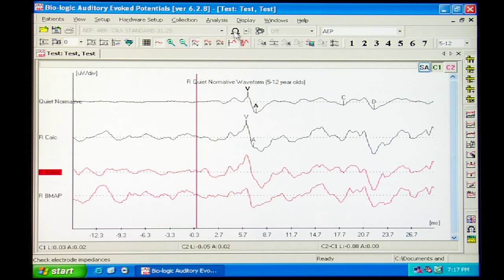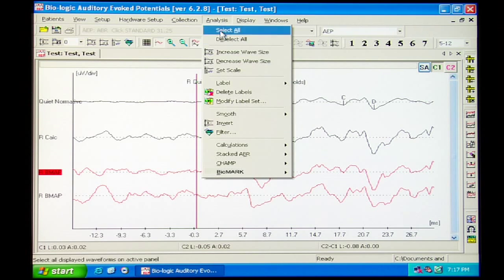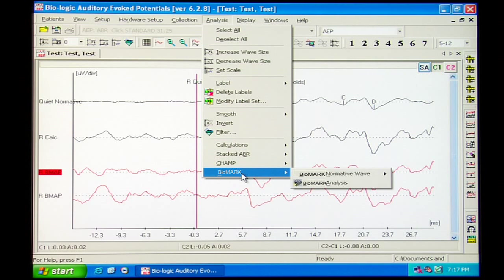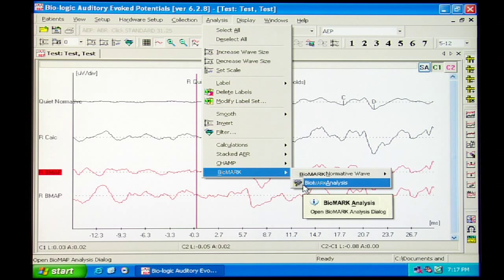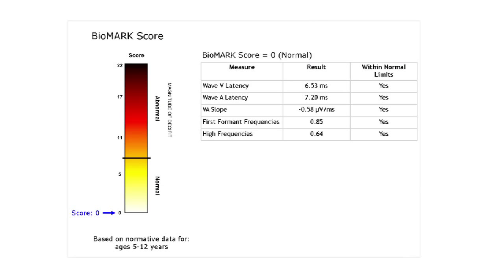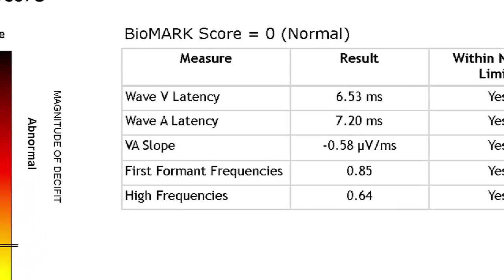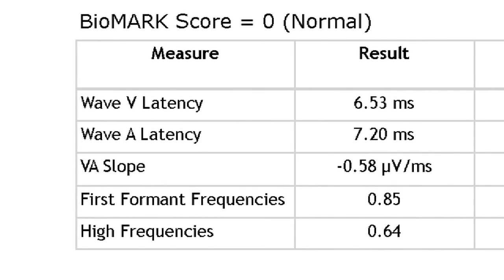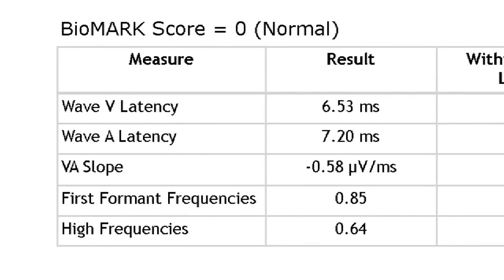You are now ready to perform the automatic Biomark analysis. Choose the Biomark analysis option from the analysis menu. The following screen will appear. The Biomark results are based on five measures: the timing of waves 5 and A and the slope between them. The last two measures are derived from a spectral analysis of the response. They correspond to the brainstem representation of the frequencies that are important for speech sound discrimination.